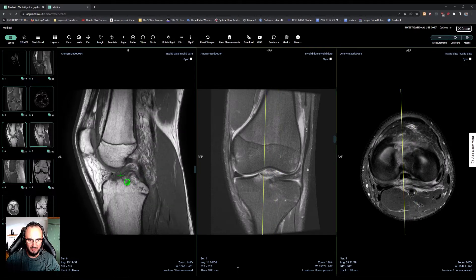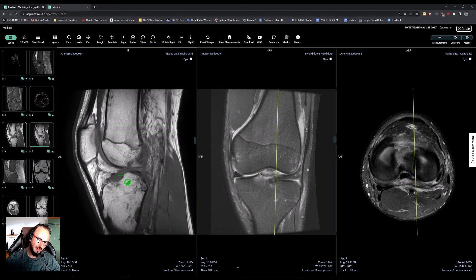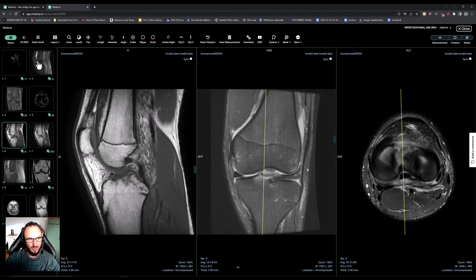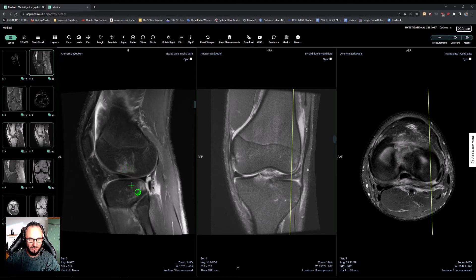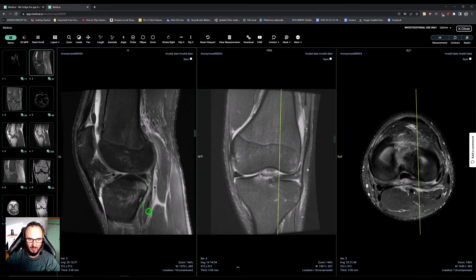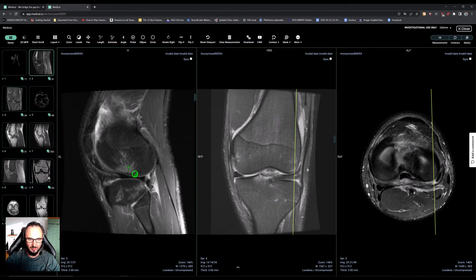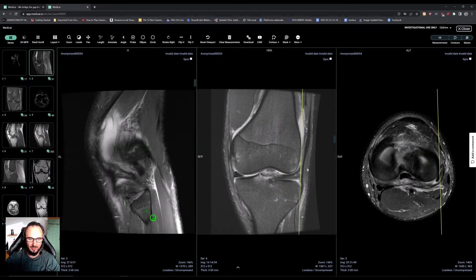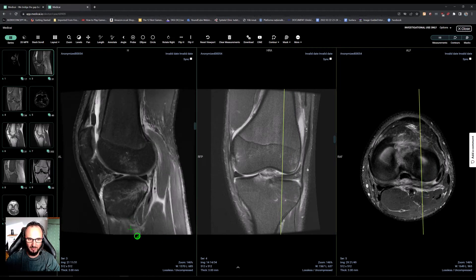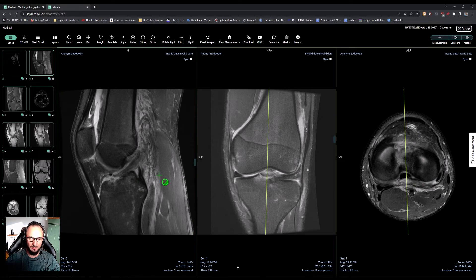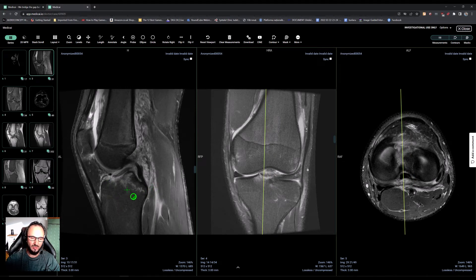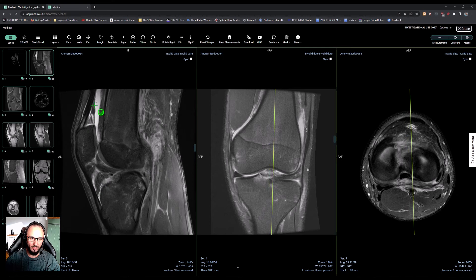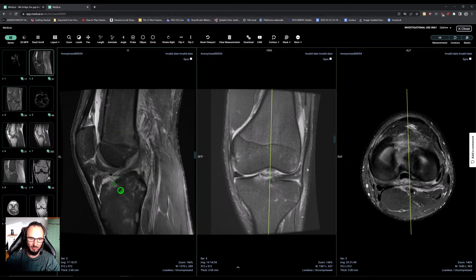T1 shows this small bone fragment poorly. But on the sagittal PD fat sat, we appreciate a pattern of bony contusion of the lateral femoral condyle and posterolateral tibial plateau — which is a pivot shift sign. So we expect to find ACL involvement. It's actually an avulsion. That's why we have fluid here and some fat, which comes from the bone.